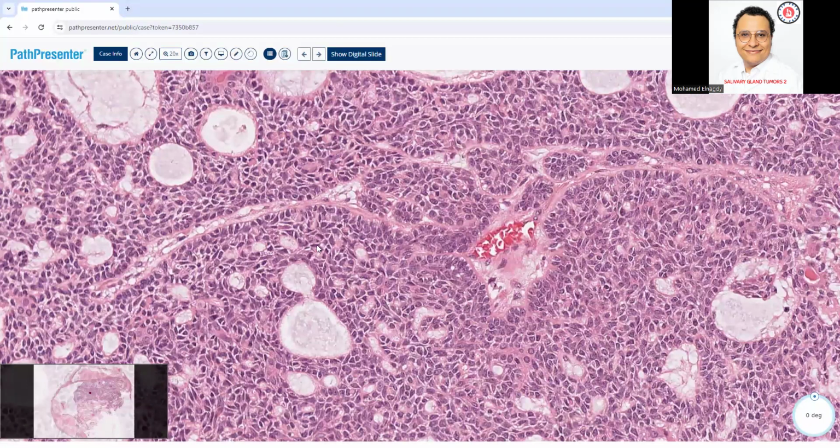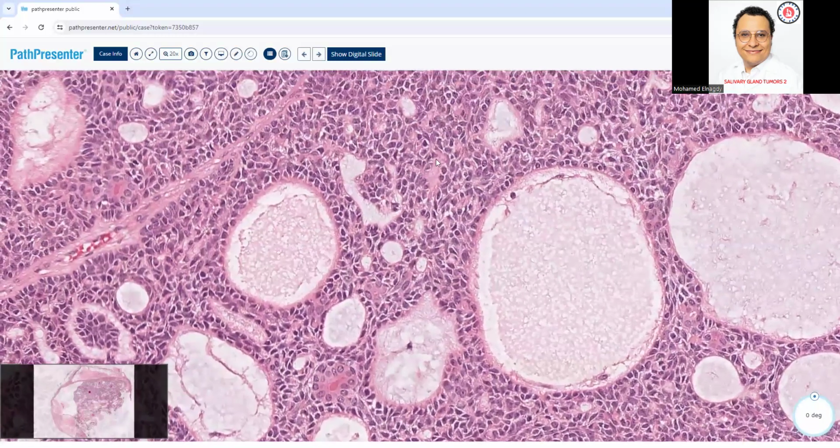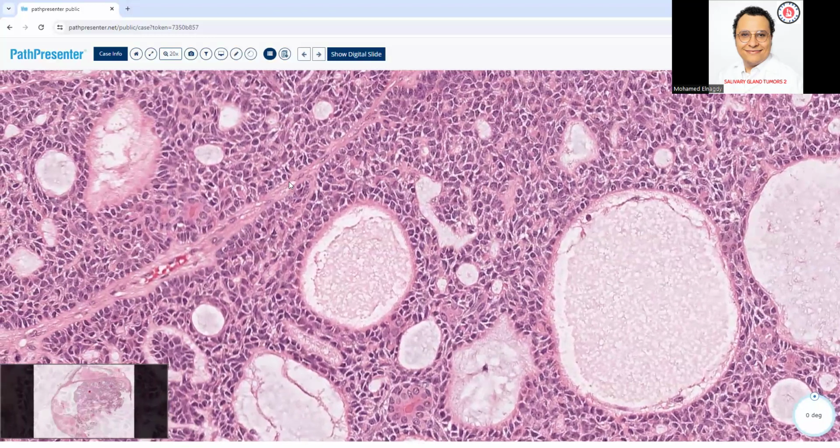Do you think that these cells are having tubules? Yeah, kind of nests and tubules. So kind of tubules with some crowded cells in the surrounding, and then there is this thing on the periphery of the cells. Is it monomorphic? Yes, that's the monomorphic. Basal cell adenoma?